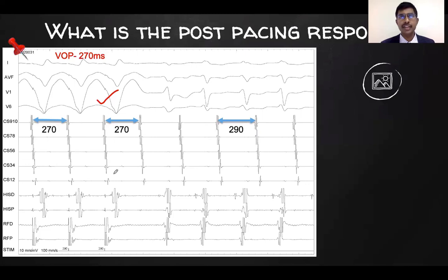What is the last entrained atrial beat? This is the last entrained atrial beat. So what's the response? VAHV.